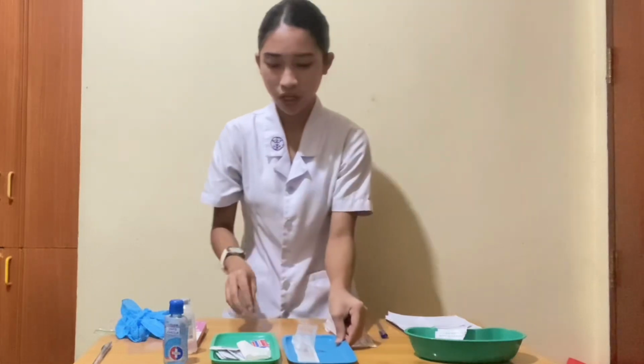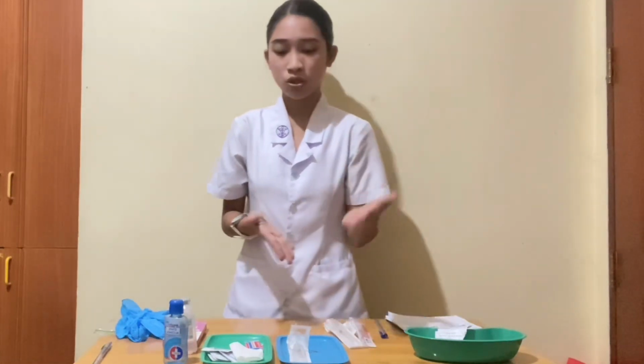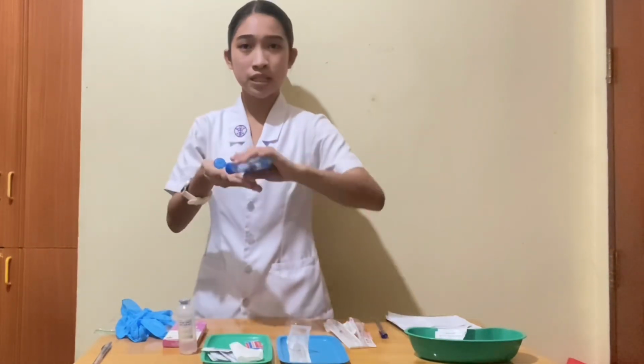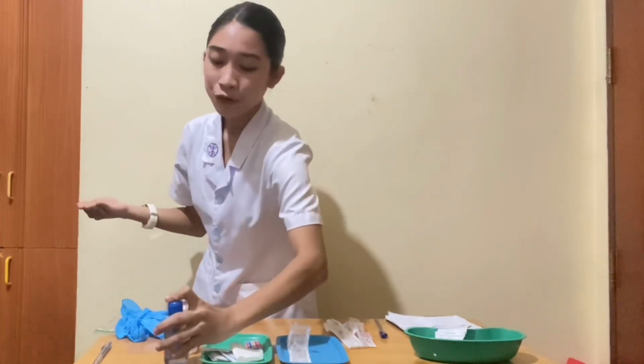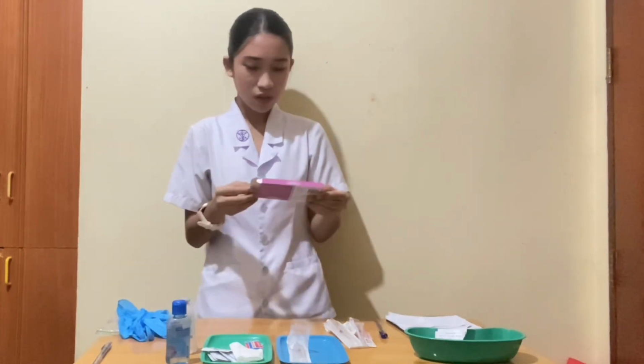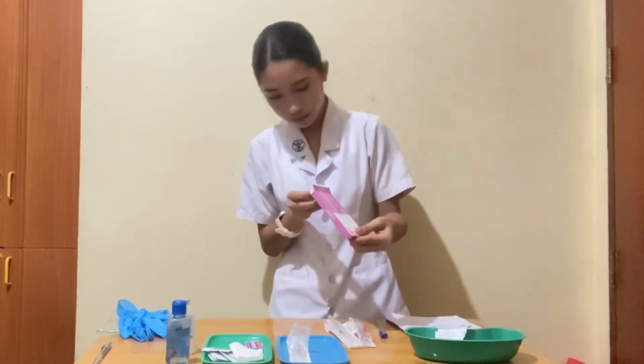Here's the medicine tray that I'm going to bring with me when I go to the room of my patient. Now I'm preparing the medication from the ampules. Perform again the hand hygiene to deter the spread of microorganisms, and again read the label of the medication before withdrawing to ensure accuracy and the right medication. So this is the vitamin K.